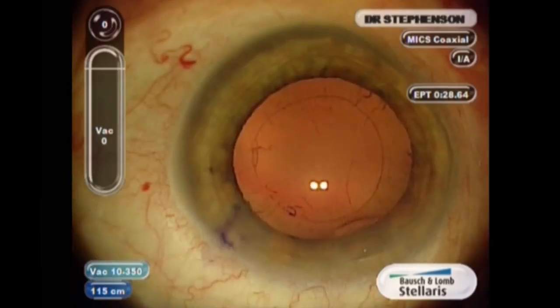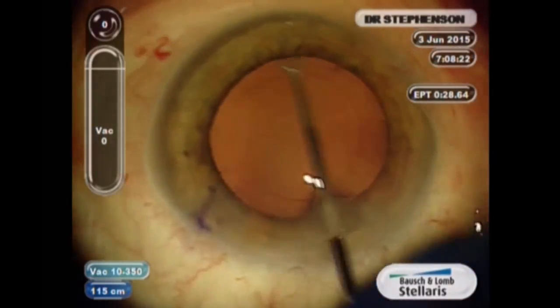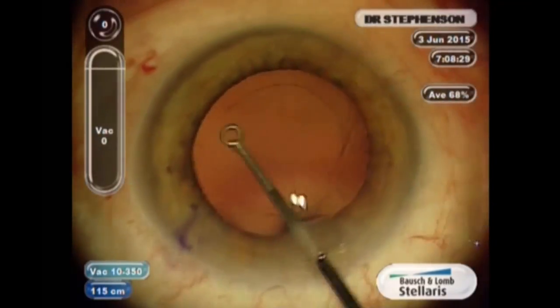Once the phaco is performed, I think it's very important that we polish our capsule for any kind of implant that you use. I use a capsule polisher that is diamond-dusted and I try to dust the posterior capsule as well as the anterior leaflets.